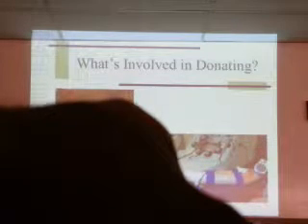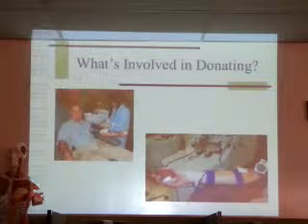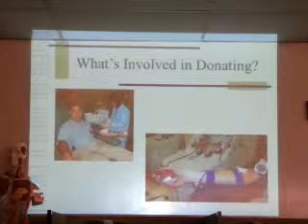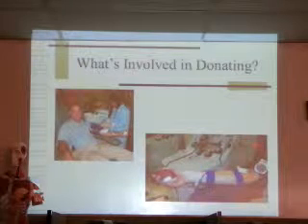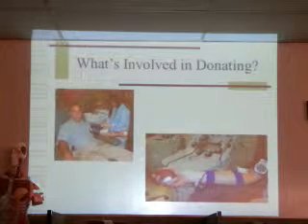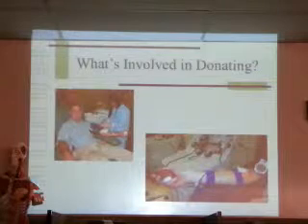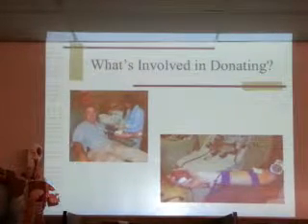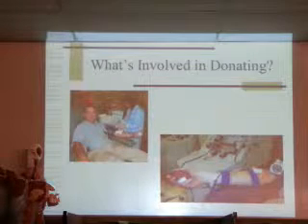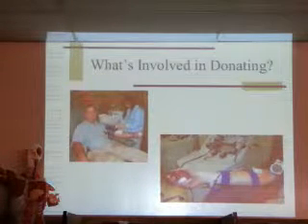So if you qualify to donate, you can either donate whole blood, which takes about 30 minutes tops. They don't want to take longer than 30 minutes to collect the blood from your arm because there's that risk of clotting. Or if you qualify to donate platelets, you can be placed on a platelet-pheresis machine. It removes whole blood from your arm. It goes through a centrifuge that will remove just the platelets and send everything back to the donor. So you're not losing red cells, you're not losing plasma. You're just donating platelets and a little bit of plasma. This takes about an hour and a half on average to donate platelets. Some people with really good high platelet counts might take an hour.